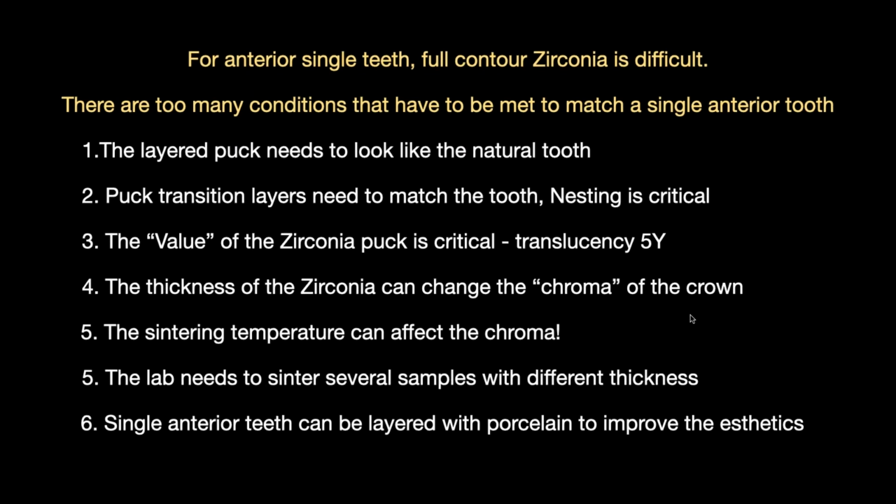You need to sinter several samples with slightly different thicknesses. The bottom line is, you can improve your predictability if you've already fired a few sample crowns to get to know the material better.